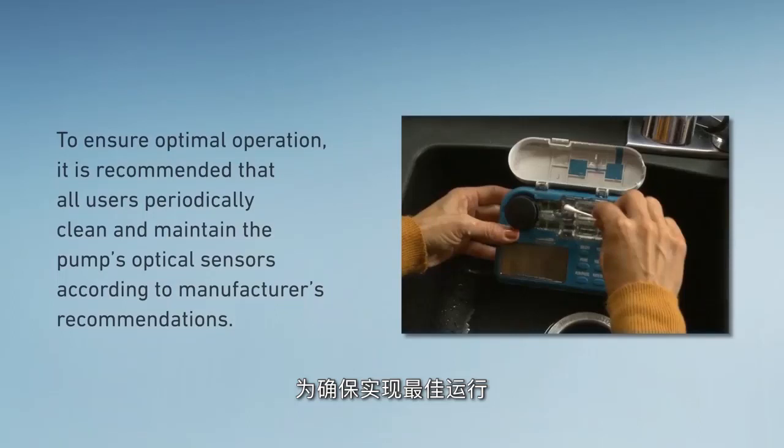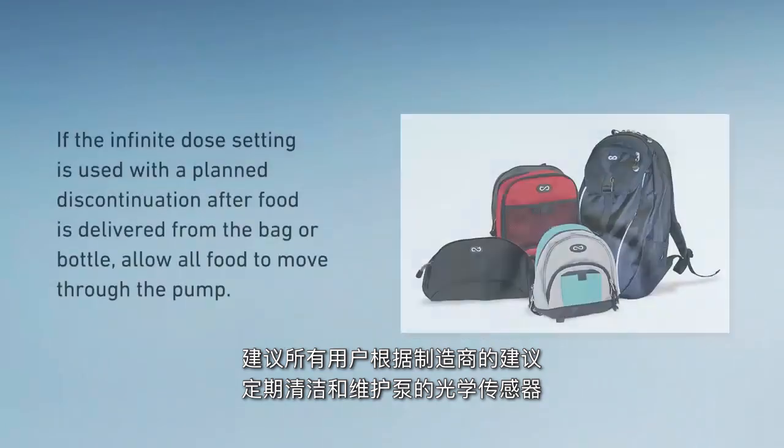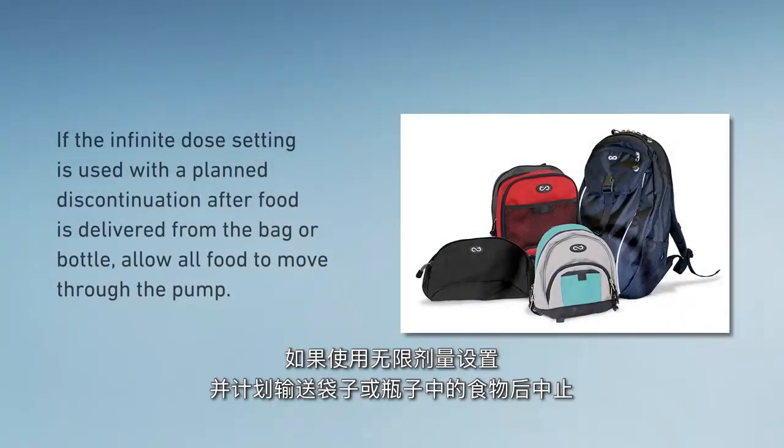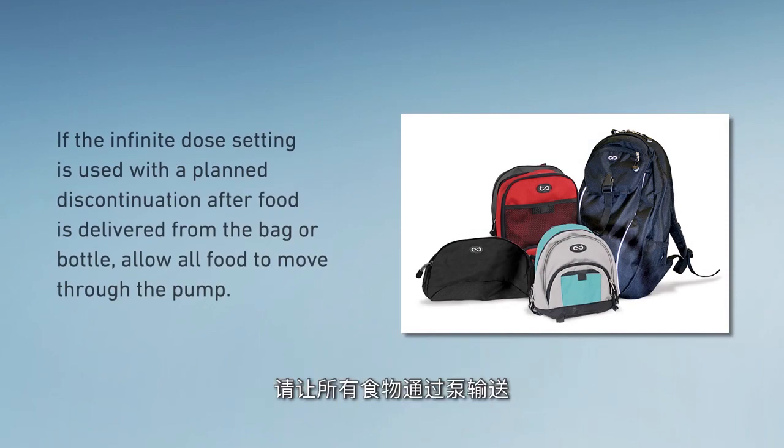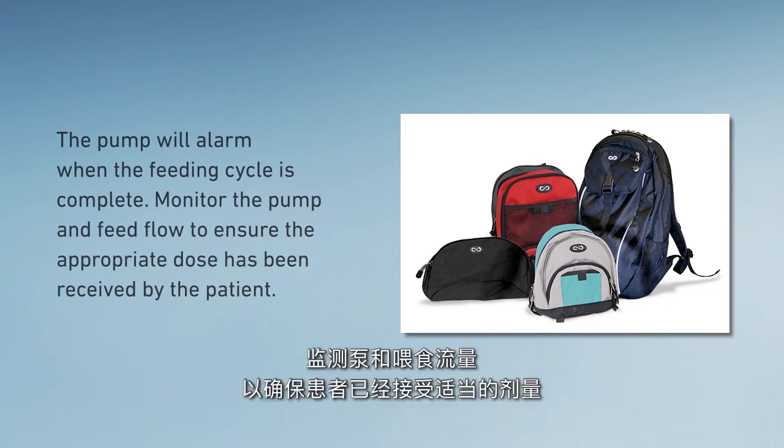To ensure optimal operation, it is recommended that all users periodically clean and maintain the pump's optical sensors according to manufacturer's recommendations. If the infinite dose setting is used with a planned discontinuation after food is delivered from the bag or bottle, allow all food to move through the pump. The pump will alarm when the feeding cycle is complete. Monitor the pump and feed flow to ensure the appropriate dose has been received by the patient.